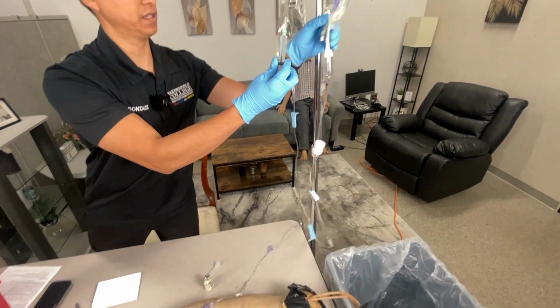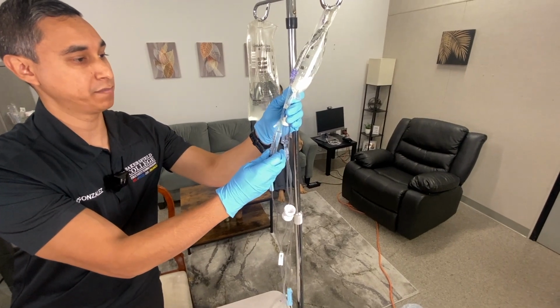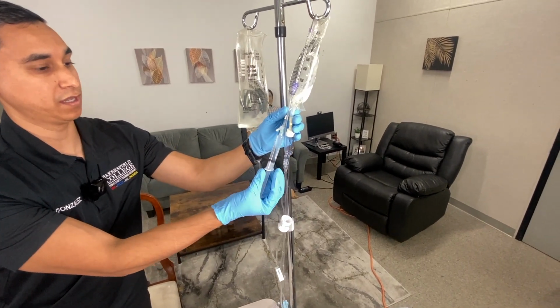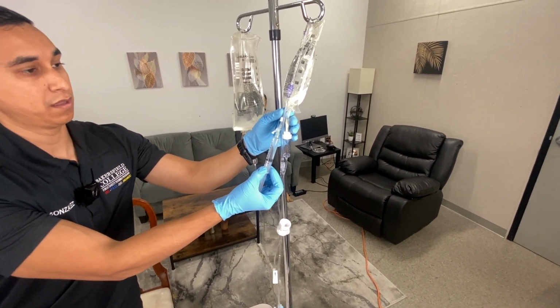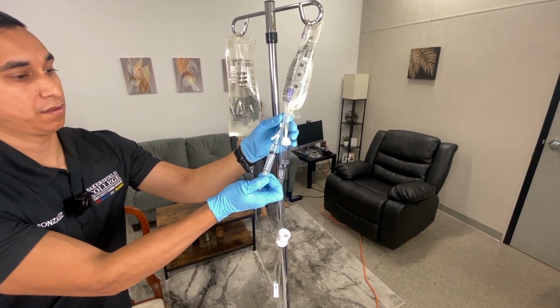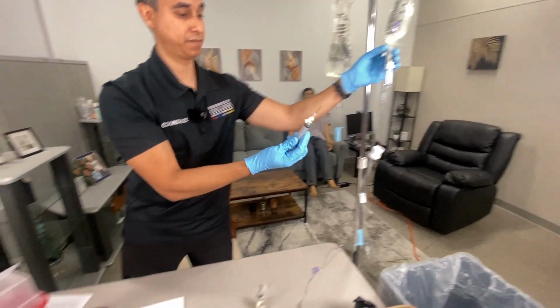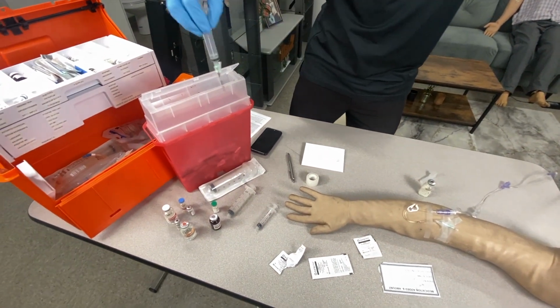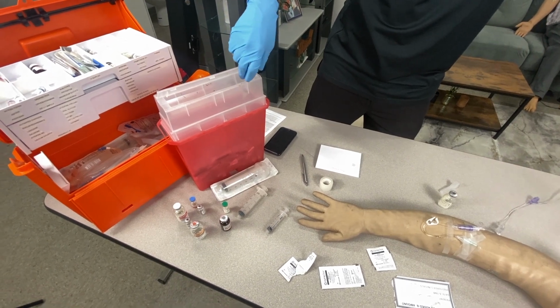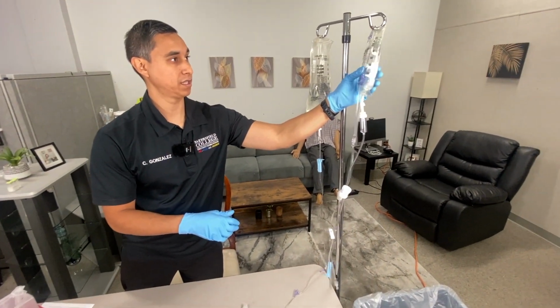I'm going to inject it into what is now going to be my medication bag, which is my 250 ml normal saline bag. All right. I am going to dispose of my sharps in the sharps container. I am going to mix the medication thoroughly.